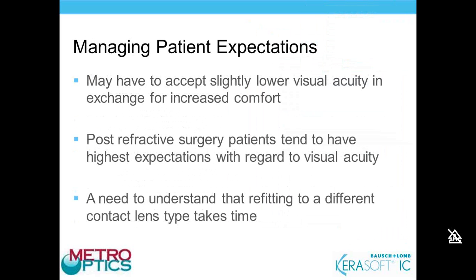And lastly, we need to understand with the patient that refitting to any type of contact lens for an irregular cornea does take time, including the KeraSoft. It's just like any other specialty lens. It might take more visits for the patient, but ideally they'll end up with good success.